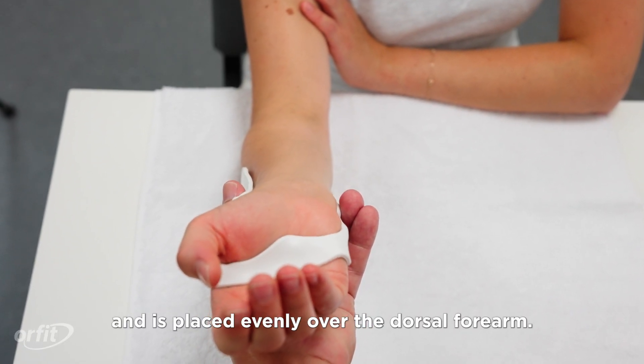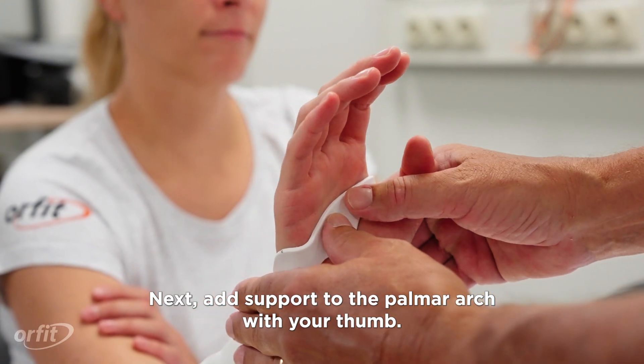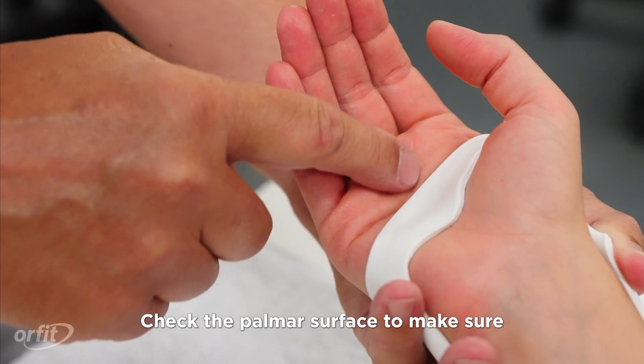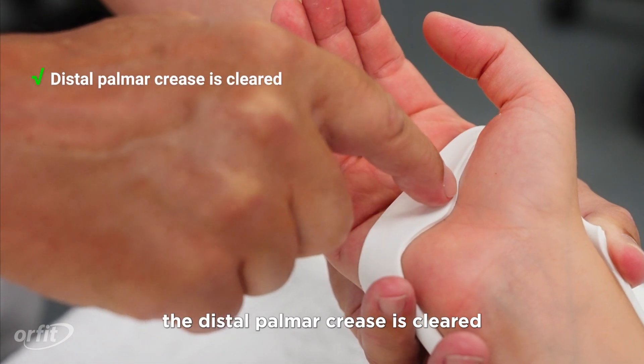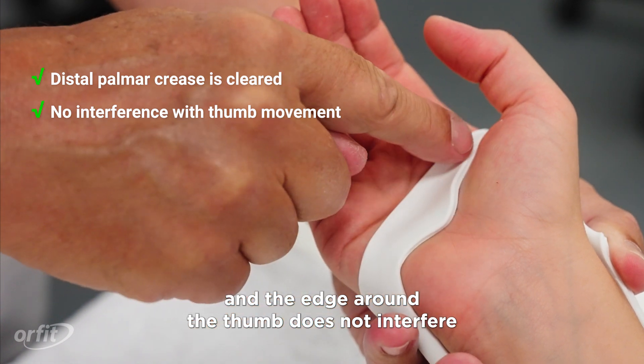Make sure the design sits comfortably and is placed evenly over the dorsal forearm. Next, add support to the palmar arch with your thumb. Check the palmar surface to make sure the distal palmar crease is cleared and the edge around the thumb does not interfere with thumb movement.